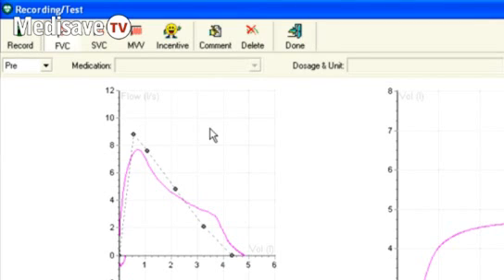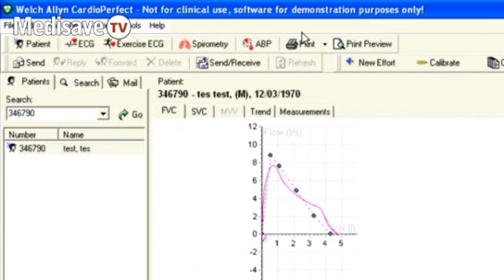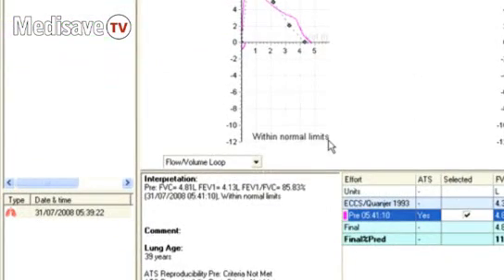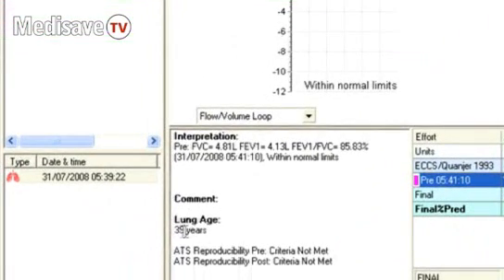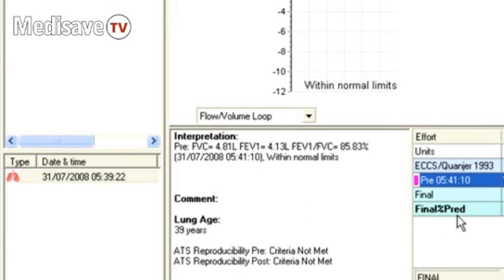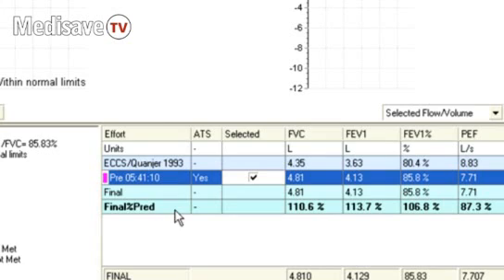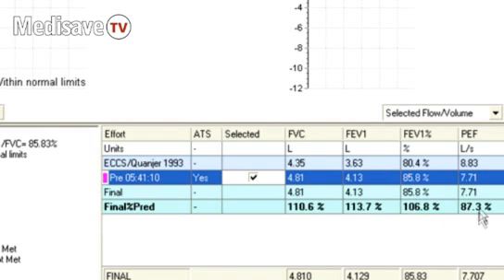At the end of the test, you click Done. All the test results are then displayed on the screen together with a lung age, based on the patient's performance in the spirometry test. The software will work out what the best blow was in the FVC, their FEV1, the ratio between those two, and also take the best peak flow measurement.